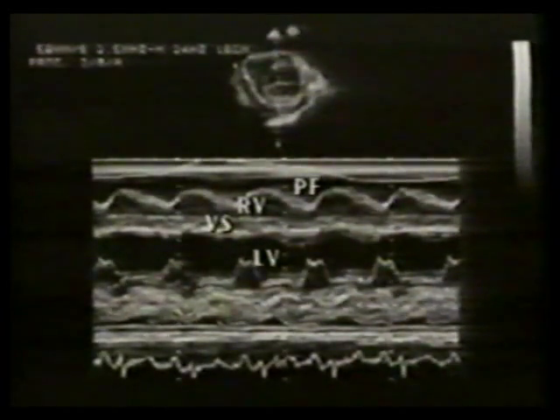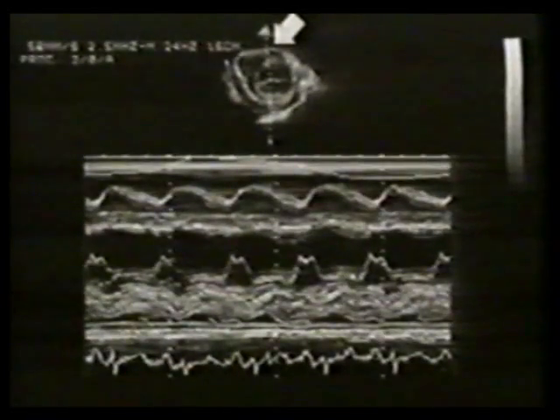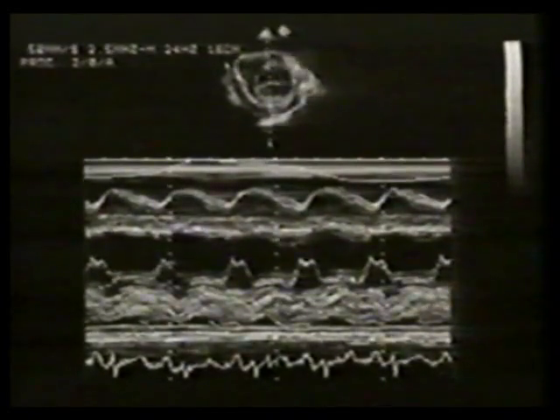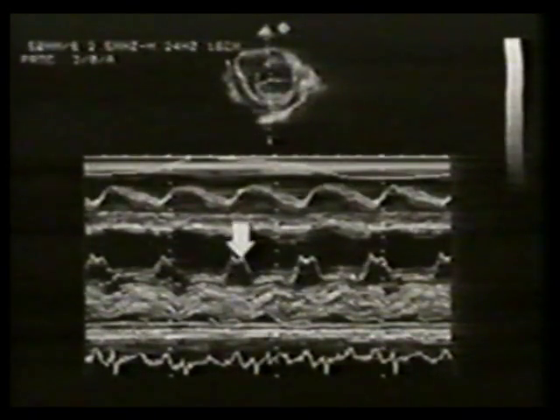The diastolic timing of the RV collapse can be verified by M mode. Here the M mode cursor crosses the short axis image at mitral valve level. This is the collapse or notching of the right ventricle. From the ECG and from the mitral M mode, you see that the RV collapse occurs in diastole.